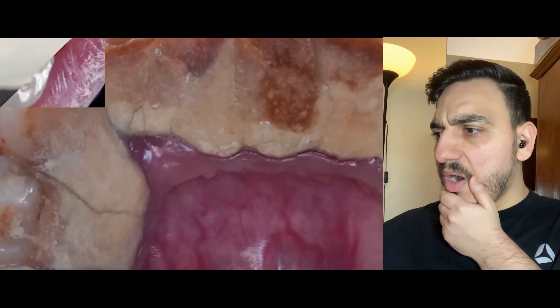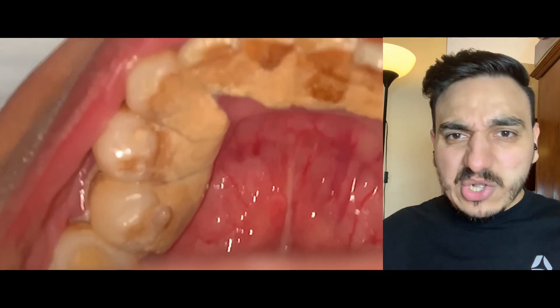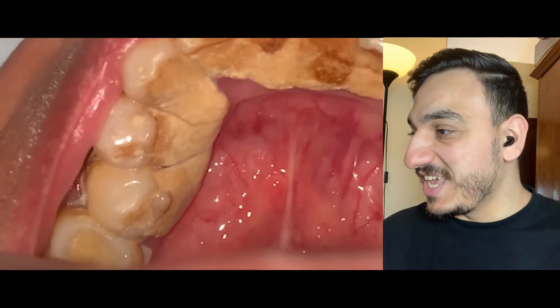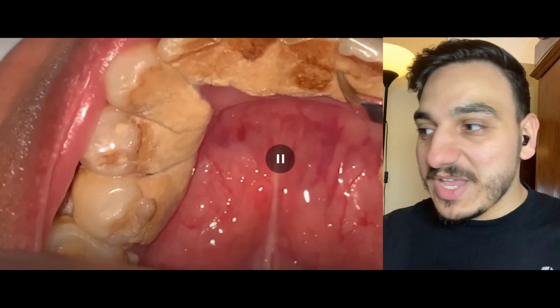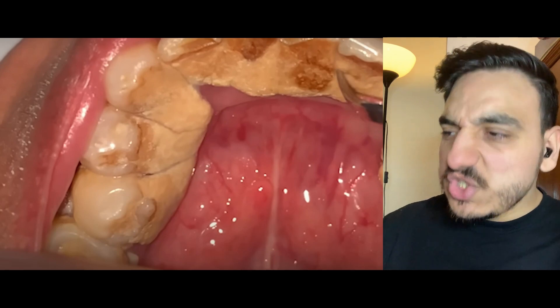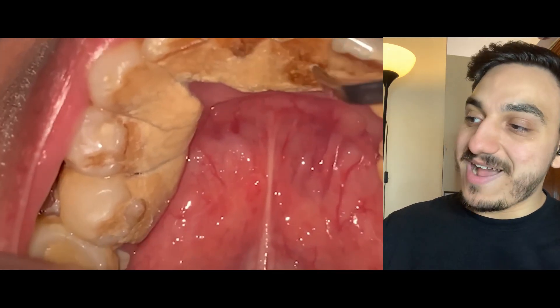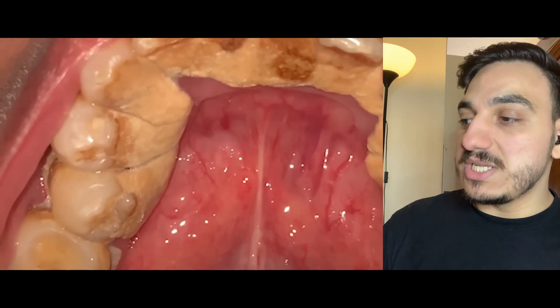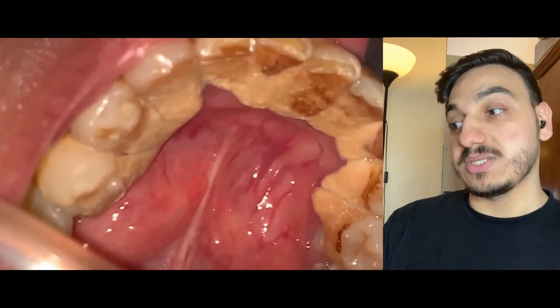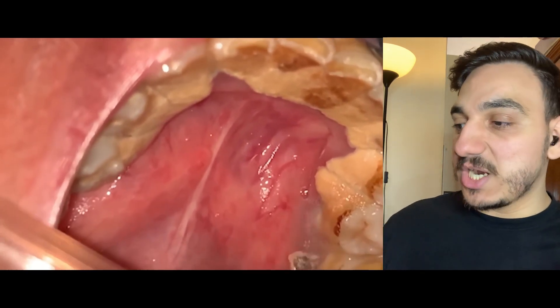What are these walls — not accumulation blocks, but walls of dental tartar and dental calculus! That is huge. What's up everyone, my name is Dr. Mo and I'm a dentist. Let's watch the cleaning and removal of these huge chunks of dental tartar and dental calculus. Watch till the end because we're going to watch how they remove these massive portions, as well as how to prevent this from being you in the future — because it can be you, trust me.